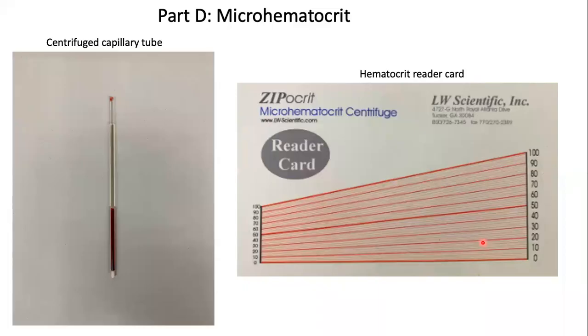Take a look. Super cool. This is the blood sample after it was centrifuged. Here's a packed red blood cells, and then right here is a buffy coat. You can't see it very well, but it looks like this white sort of layer, and that is where the white blood cells and the platelets are. And then you see this golden color. This is actually plasma, and so it should be clear and golden. If it's clouding it in golden, it means you have too many triglycerides in your diet when you last ate.